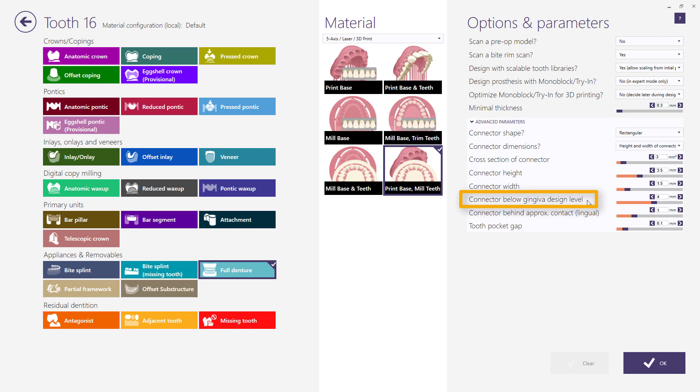The value of parameter below gingiva design level will determine the distance of the connectors to the gingiva design. And the value of connector behind a proximal contact will control the location of the connectors relative to the proximal contacts.